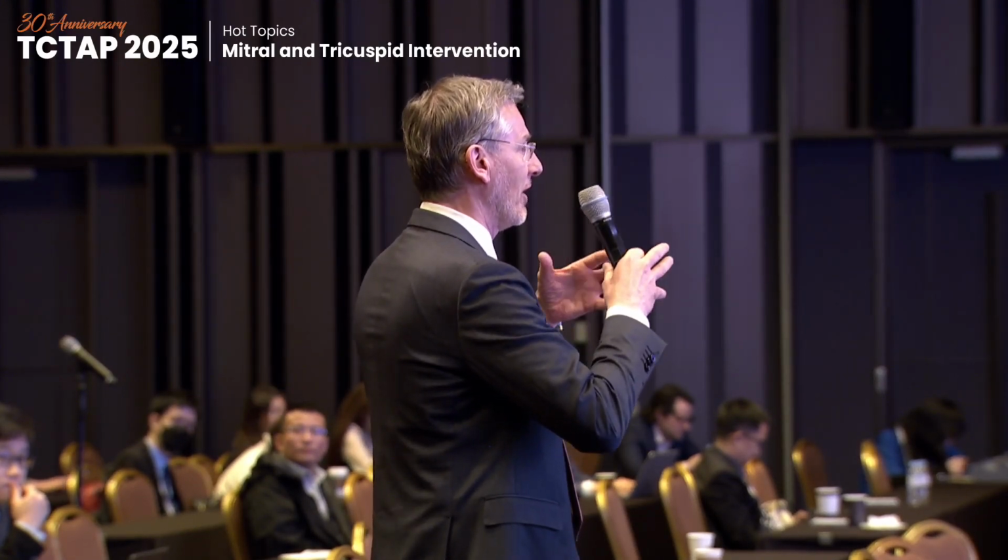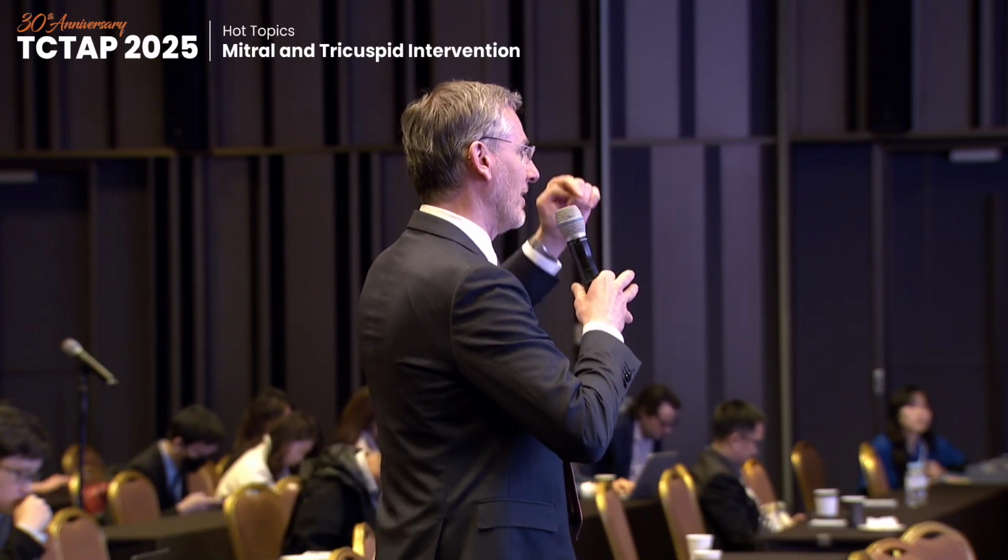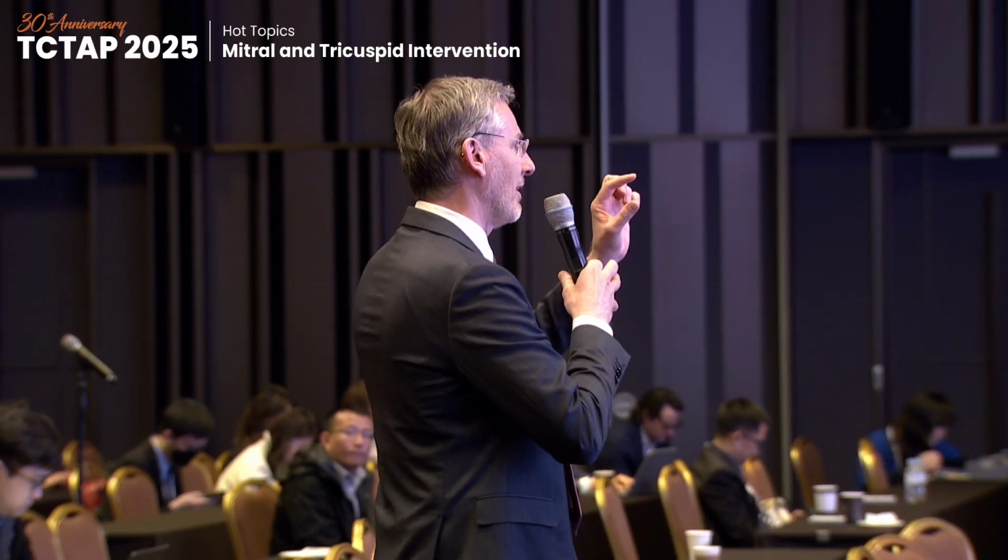So even if there is a smaller annular dimension, the mechanism of sealing will still be the coapting of the native leaflet around this valve. So I don't think there will be enough remodeling to make the long axis of the right ventricle small enough to push this valve, because the positioning of this valve is probably like 30-70 across the annulus.